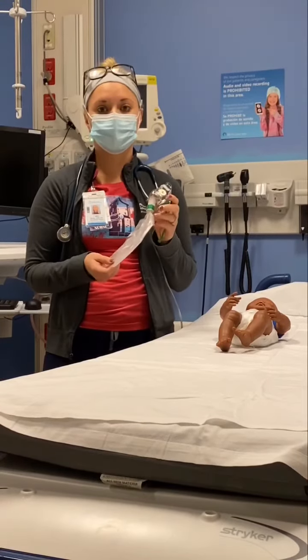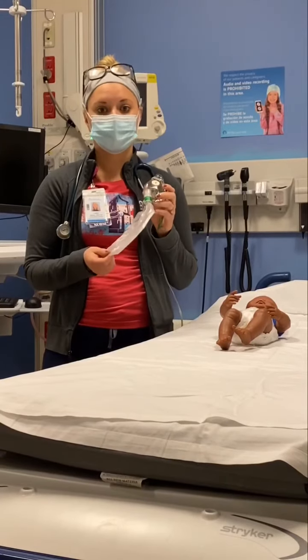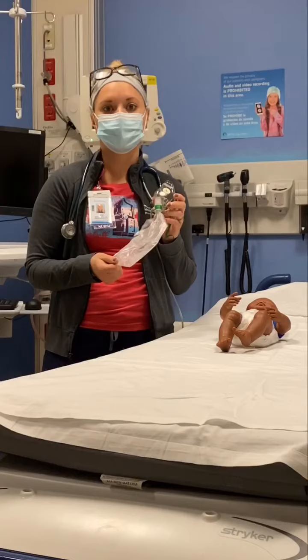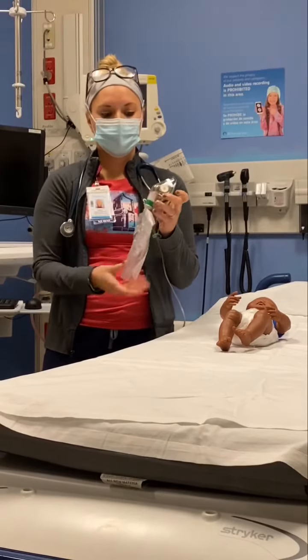The mask and reservoir system have a one-way valve that limits the mixing of oxygen supply with exhaled gases in room air. The one-way valve is located between the reservoir and the mask.